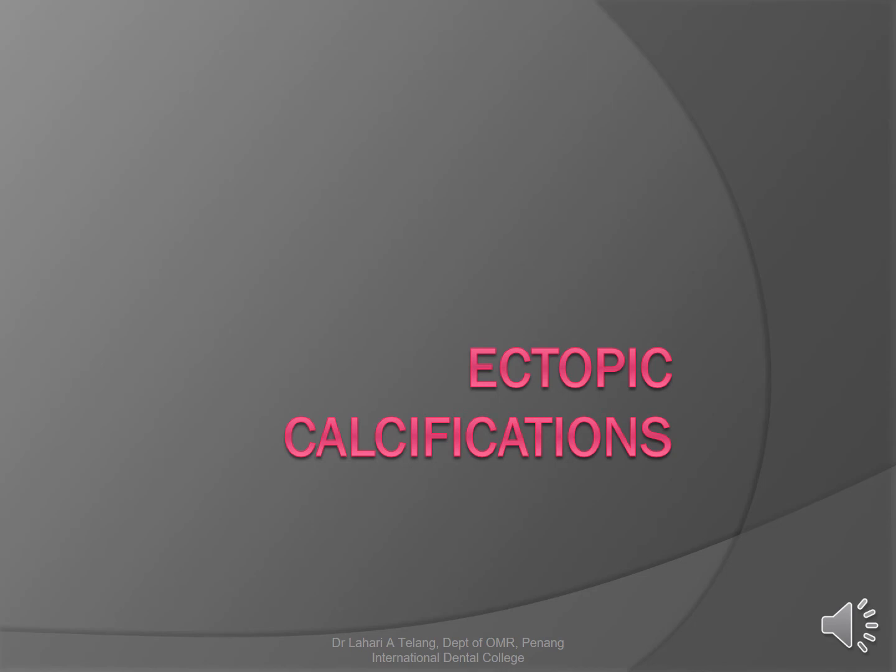So that is about systemic diseases. Like I told you, one important thing to remember is it can only give you a guidance to what the disease could be. You will still have to do blood investigations or perhaps other health checks and history taking to correlate it with the radiographic finding in case it is an incidental finding. And these general bone findings do improve with the improvement of the disease itself.